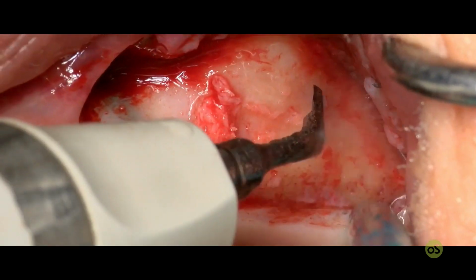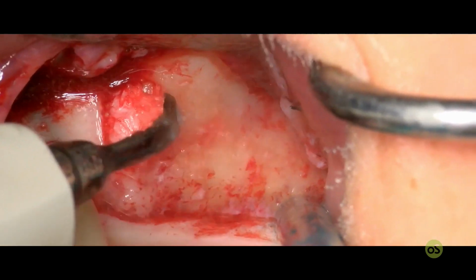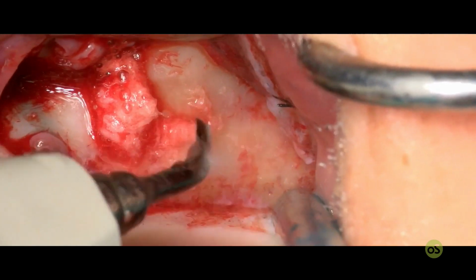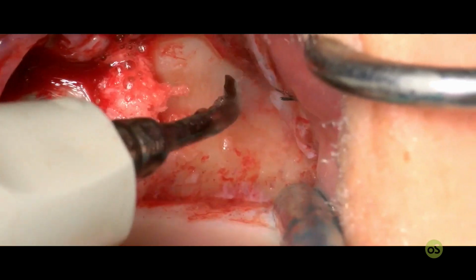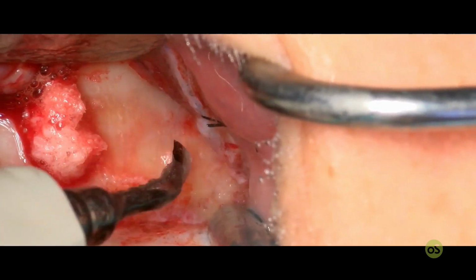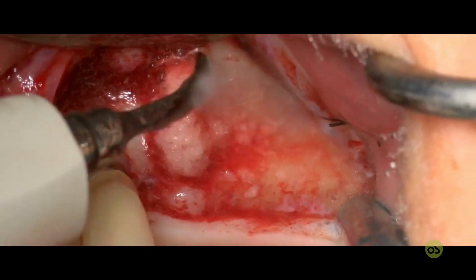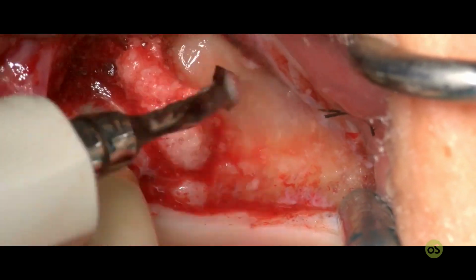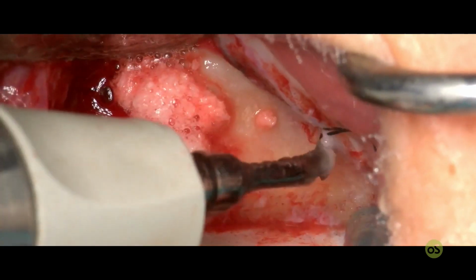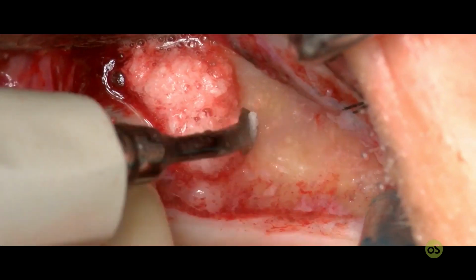The consuming technique is the most predictable technique to preserve the Schneiderian membrane integrity, to avoid the perforation. Because this technique is developed in order to reduce the thickness of the buccal cortical bone. The technique is done by the operator making an osteoplasty maneuver, very fast, as you can see, using the cavitation effect.